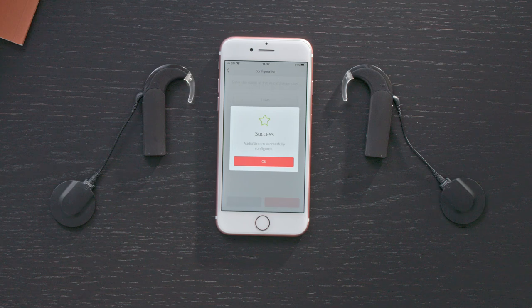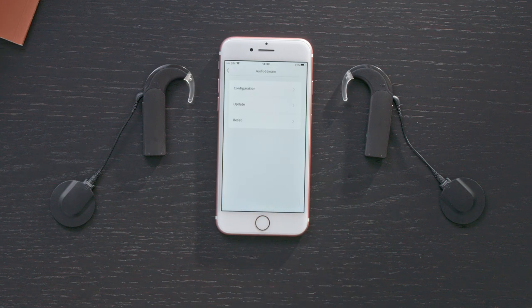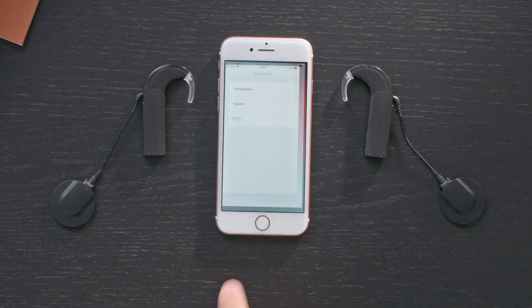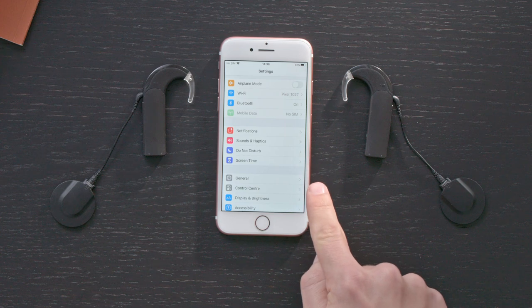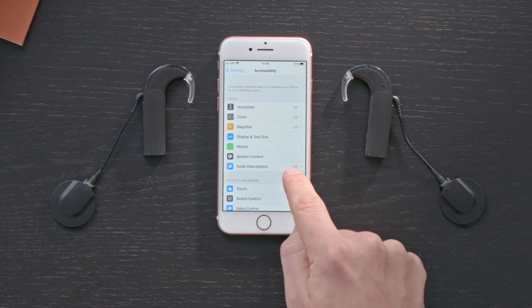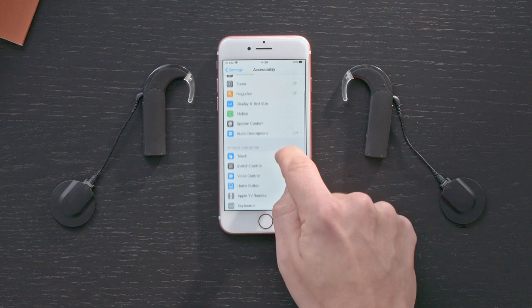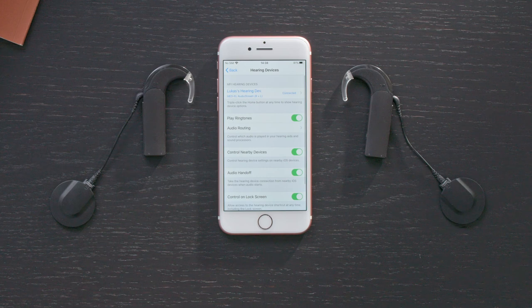Once it has paired successfully, tap OK. Exit the AudioKey2 app and go to the Settings on your iOS device. Scroll down and select Accessibility, then Hearing Devices. Tap on the section under MFI Hearing Devices.